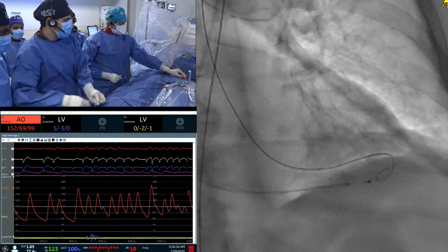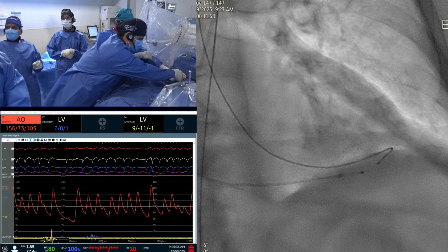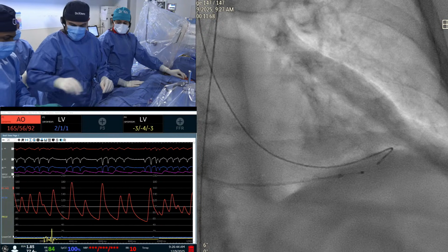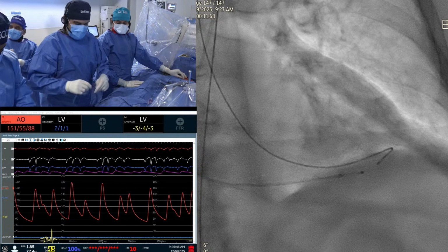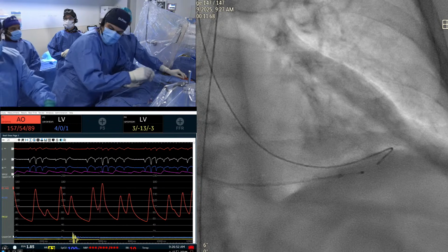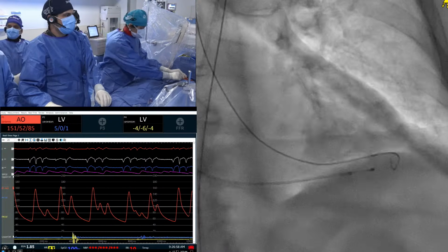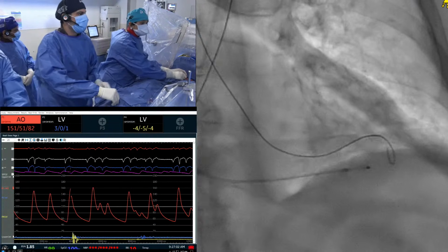So just to emphasize, we are no longer just doing the TAVR or just doing the surgical valve. We always have to think about lifetime management. So even when a surgical valve is being implanted, we always have to think about whether TAVR can be done in these cases 10, 12, 14 years down the road, and therefore choose accordingly. And of course, enlarging the aortic root is common, although they say it does increase mortality by a few percentage points. Yeah, I think you have to be careful.